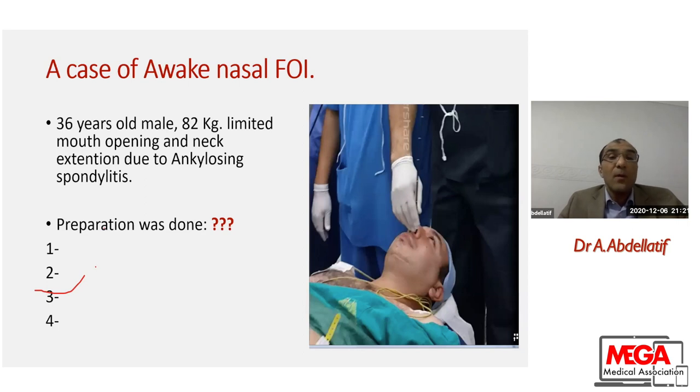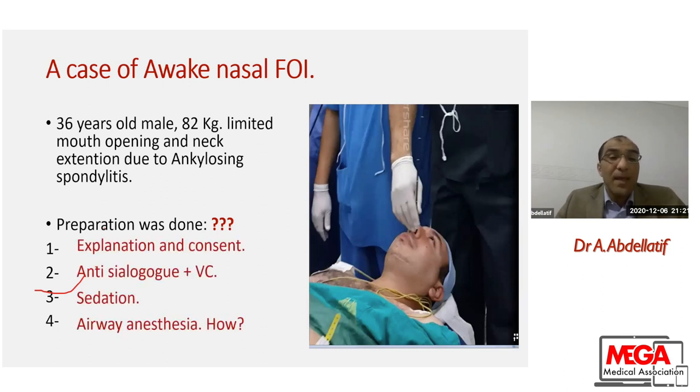And this is a case of awake nasal fiberoptic intubation: a 36-year-old male, 82 kilograms, with limited mouth opening and limited neck extension due to ankylosing spondylitis. What will we do for him? We will do awake nasal fiberoptic intubation. The preparation was done: explanation, antisialagogue, sedation, and airway anesthesia. Here we will see a 5-minute video with preparation and airway anesthesia, then nasal fiberoptic intubation. In the video, we'll see two different patients because for better video editing, I prefer to put two patients.